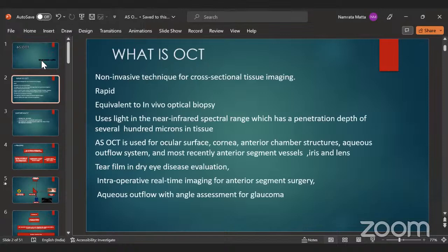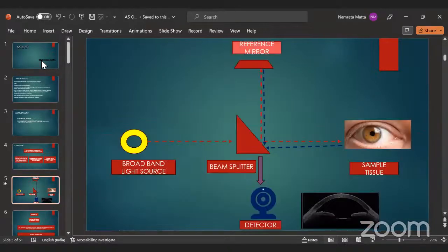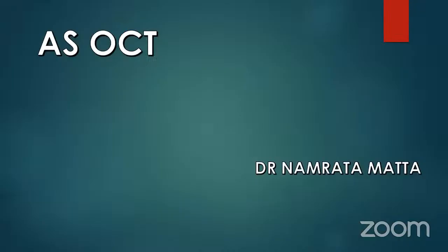So what are the ASOCT uses that you have seen so far? Sir, for anterior layer of the cornea and Descemet membrane detachment. Right. Nilambika, what is the use of epithelial thickness mapping with ASOCT?